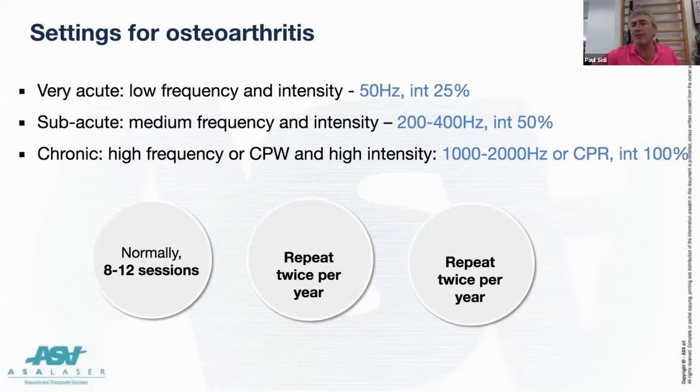However, if you've got this very chronic situation, and I use this on knee arthrosis as well, I actually do often use the CPW. I might not the very first time, but if I'm not getting the changes I want straight away, I'll get straight into the CPW. It will all become clear, for those who don't know what I'm talking about.